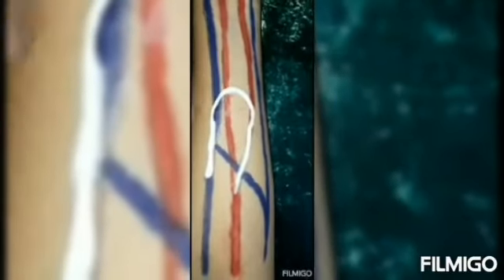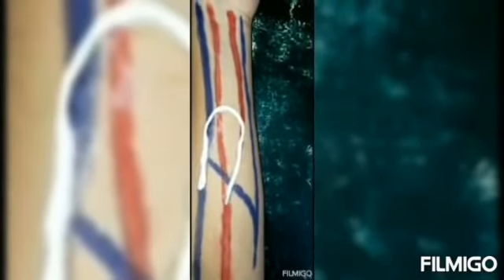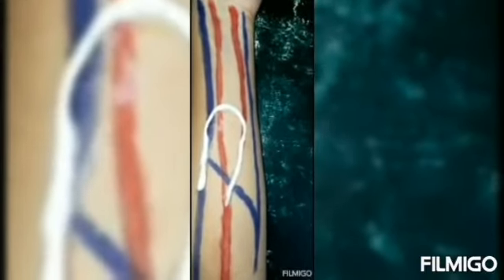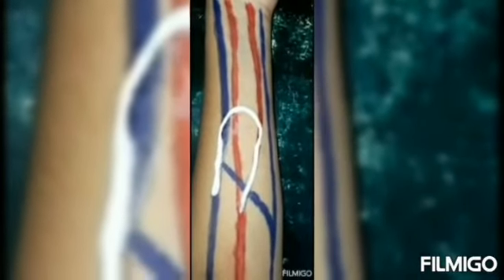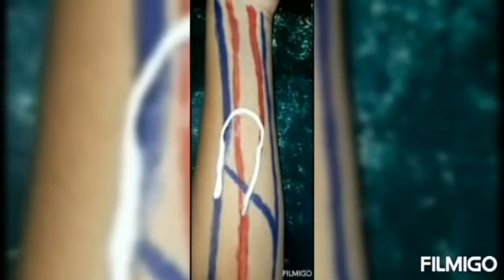One end of the tube is connected to the artery and the other end of the tube is connected to a vein. The graft provides a solution for small or weak veins. An AV graft can be used as soon as 2 to 4 weeks after the placement. Local anesthesia is administered to the area selected for the graft placement. This AV graft surgery is generally for people who need long-term dialysis and have small or unhealthy blood vessels.